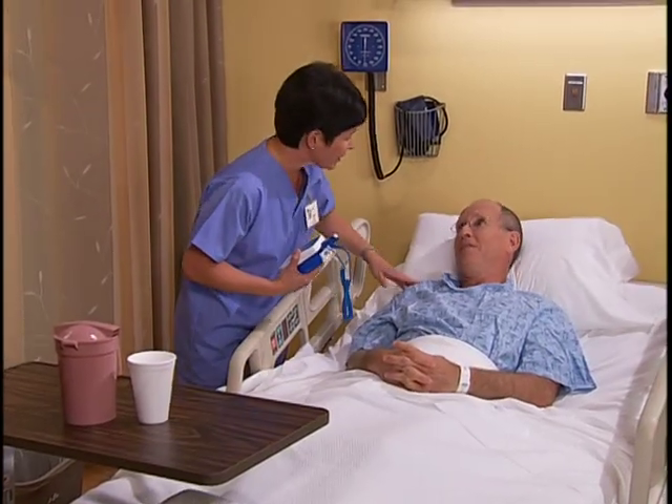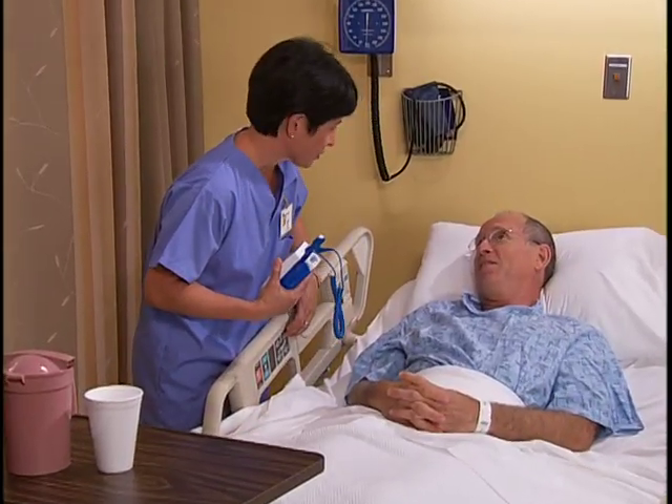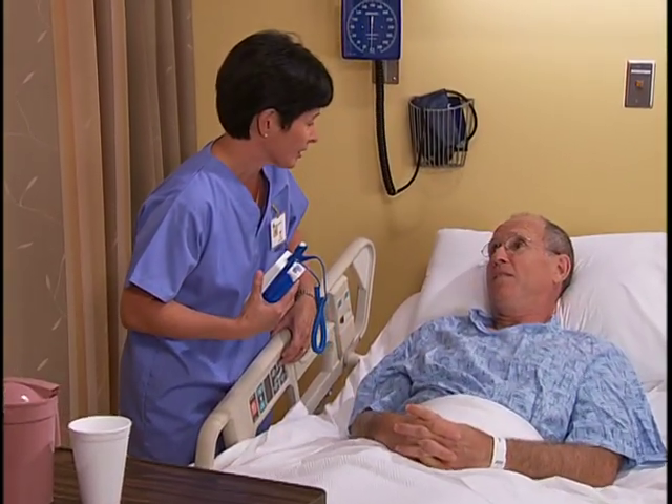Good morning, Mr. Jessup. How are you? Good morning. Help the patient into a comfortable position that allows easy access to the selected route.